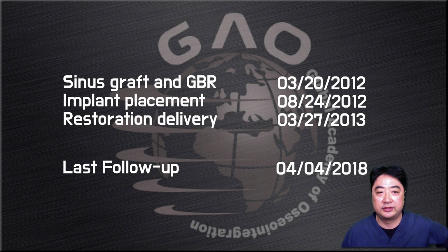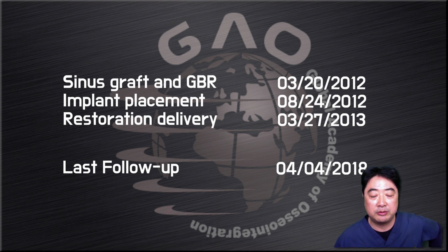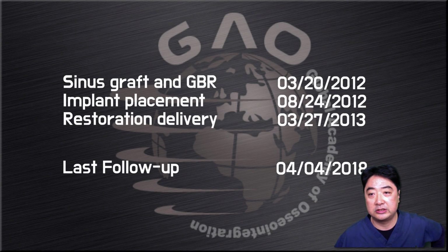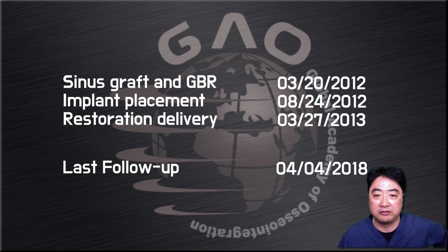The sinus graft and GBR were done in March 2012, and implant placement was done 5 months later, on August 24th, 2012. The final restoration was delivered in March 2013. My last follow-up was April 2018. So it's been almost 6 years from the sinus graft, and a little more than 5 years after final restoration delivery. So far so good with this patient.